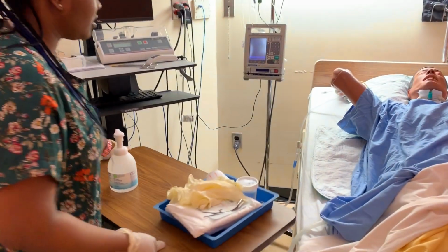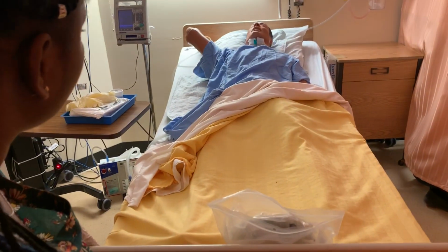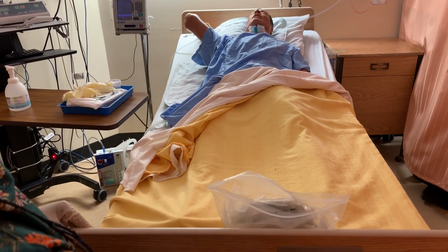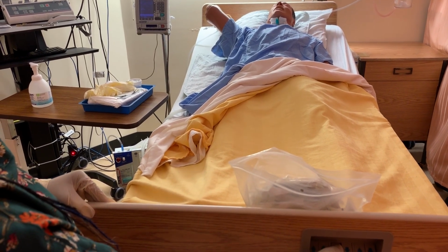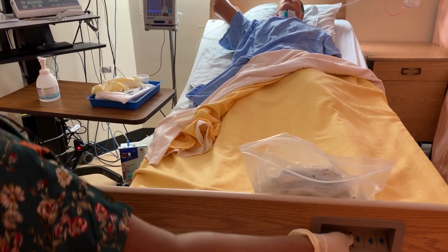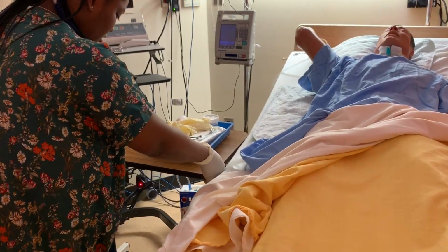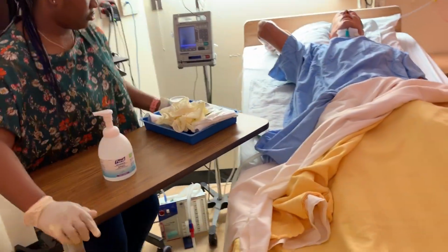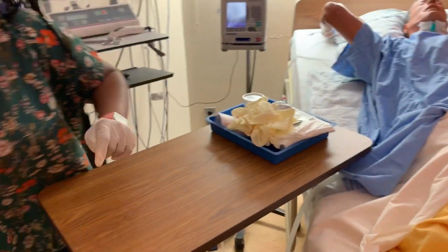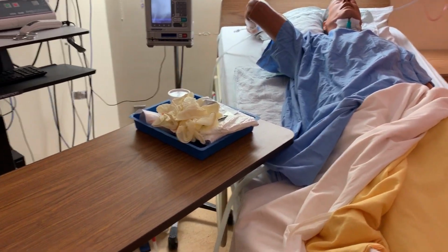So I'm going to just raise my patient's bed. Hi, I'm going to be doing a dressing change for you. Okay. So now I have to get my supplies. Pick up my gloves here.